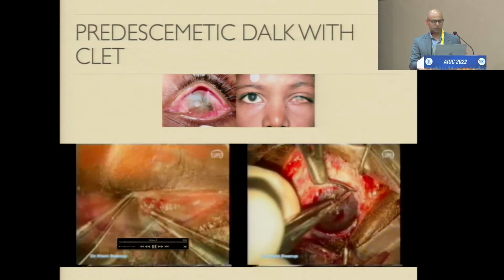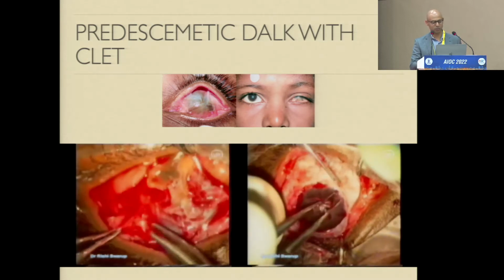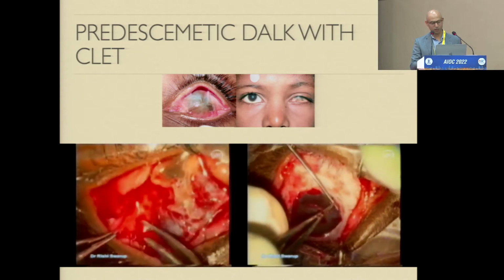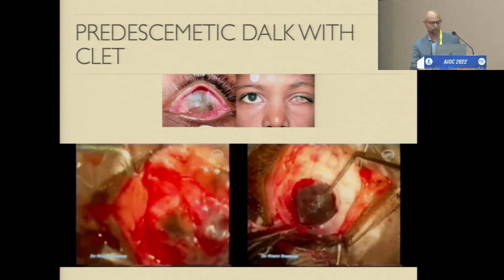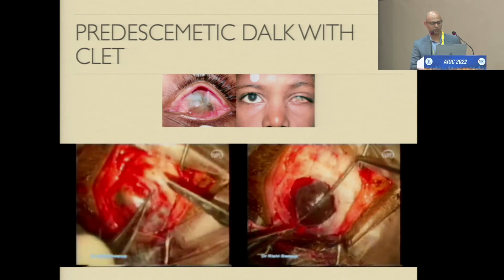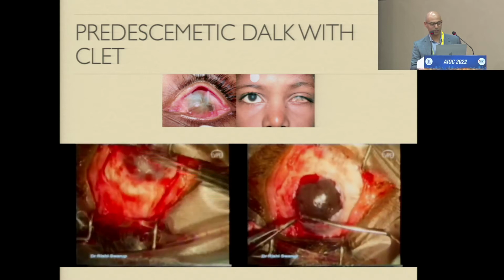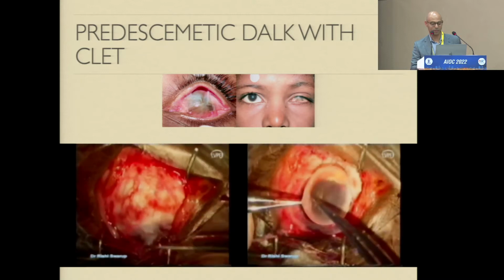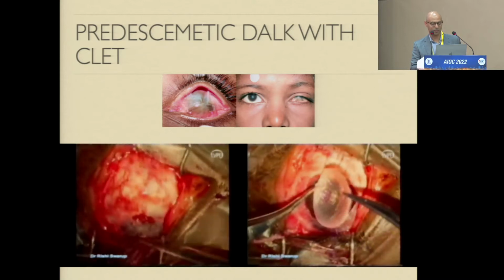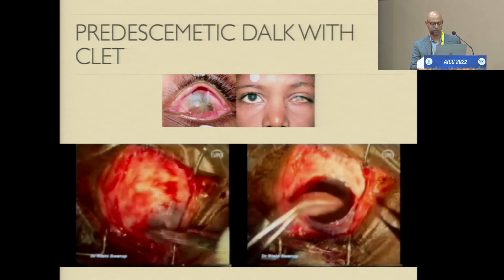Of course, this was not a groove and peel technique. This was a case that I had done at LV Prasad when I was there. This was a patient with a unilateral total limbal stem cell deficiency, with a thinned out cornea and scarred cornea. Because there was a risk of amblyopia, we decided to do a DALK primarily, and you can see I've used this iris repositor to do layer by layer dissection, and then put a large diameter graft, which is about 11 mm.